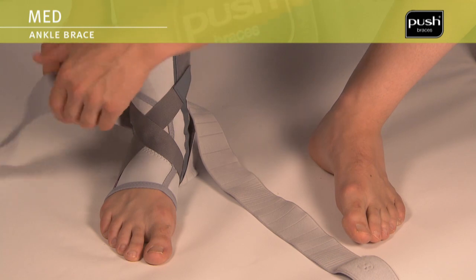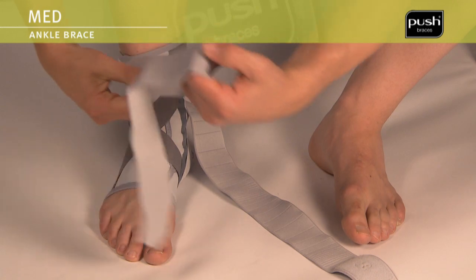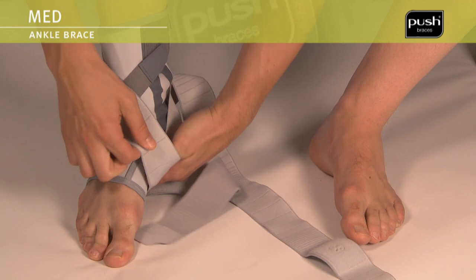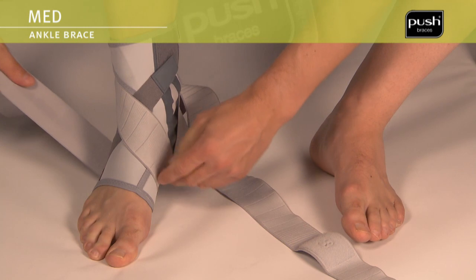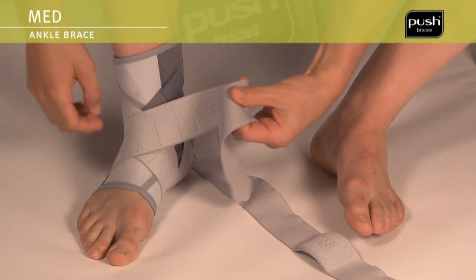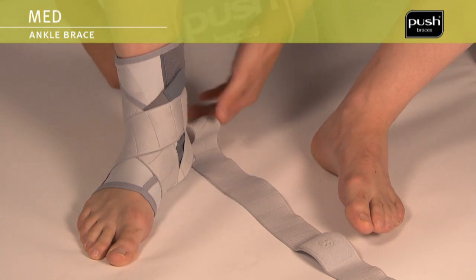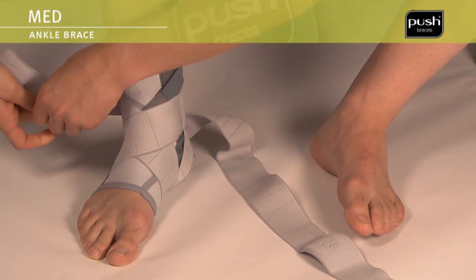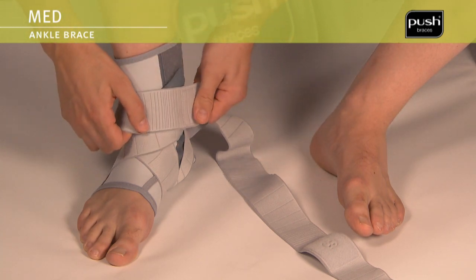The elastic bands are wound around the foot in the shape of the figure 8. Start by tensioning the heel lock. Position the band diagonally across the instep in the direction of the inner foot, then pull the band underneath the foot towards the outside and diagonally across the instep to the inside of the lower leg. Close the elastic band with a single wrap around the lower leg.